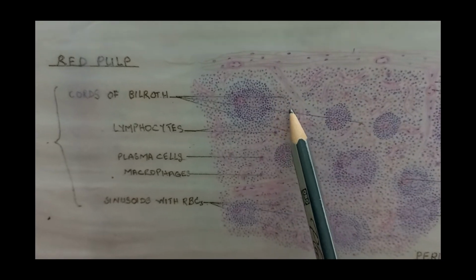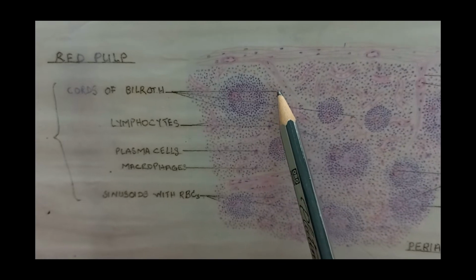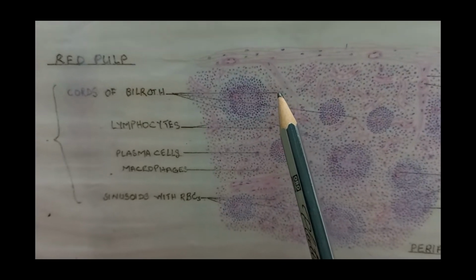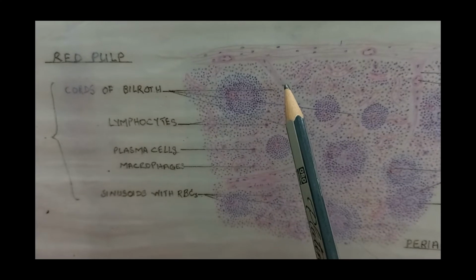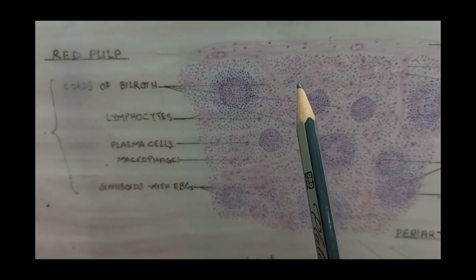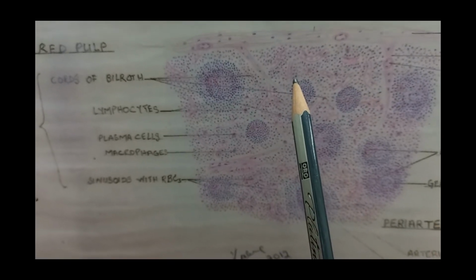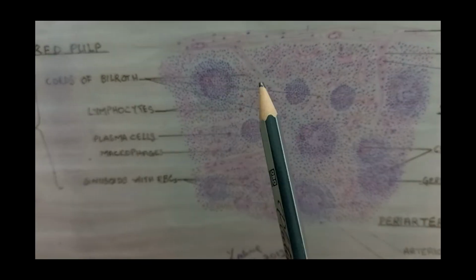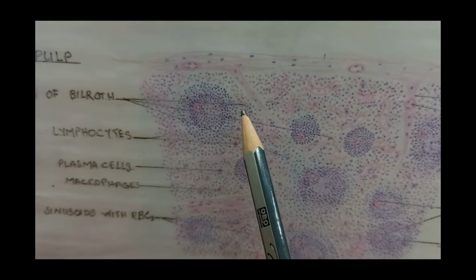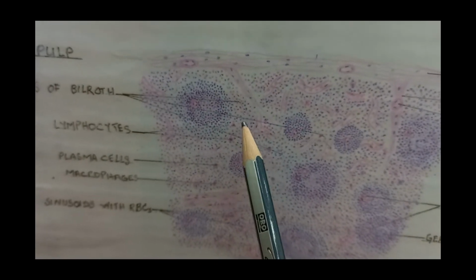First one is the red pulp. In the red pulp, you can see mainly two structures. Number one are the splenic cords, or you can say the cords of Billroth. These splenic cords have erythrocytes, lymphocytes, plasma cells, platelets, macrophages, dendritic cells, and all these cells are supported by the reticular fibers and the reticular cells. Then you will also find in the red pulp a lot of erythrocytes, which you draw with the red color.